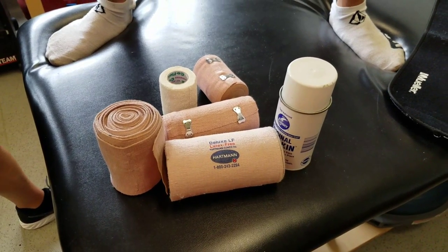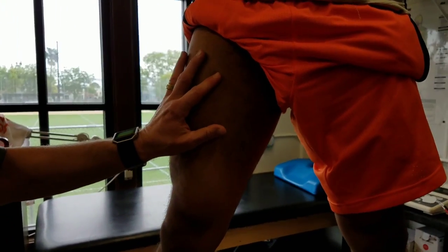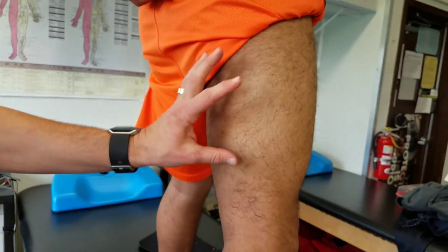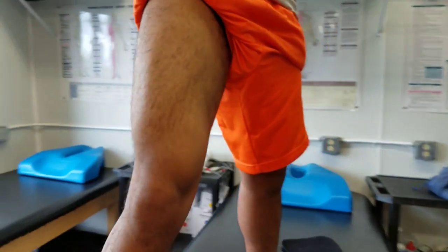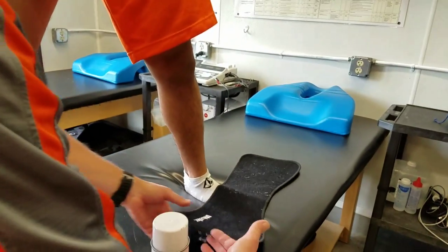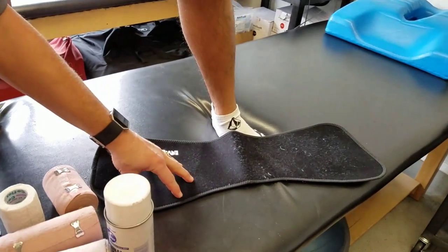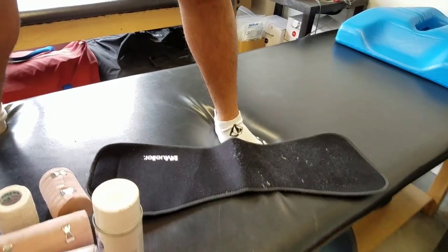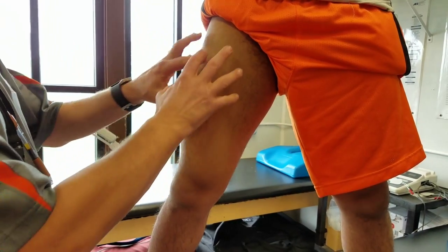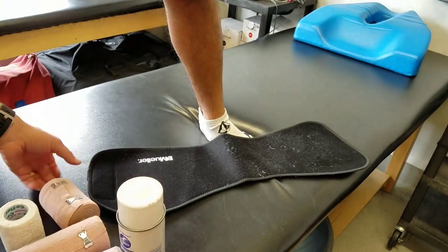This next wrap — we can actually apply the same principles for either a quadricep or the posterior part of the thigh, the hamstring. Before I do the wrap, I'll show you these neoprene-type wraps that are velcroed and kind of one-size-fits-all. I like to use those when dealing with quad or hamstring strains, but you might not have something like that.